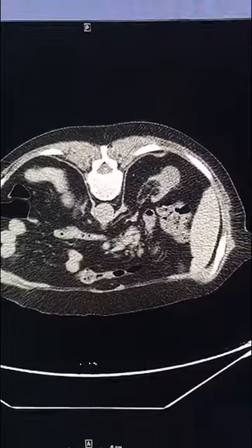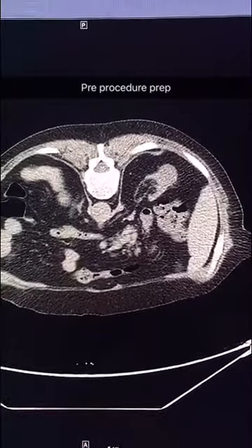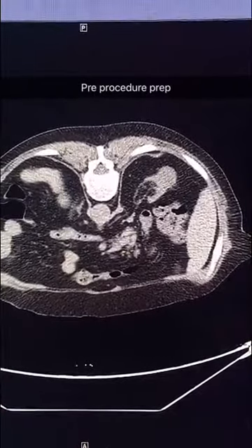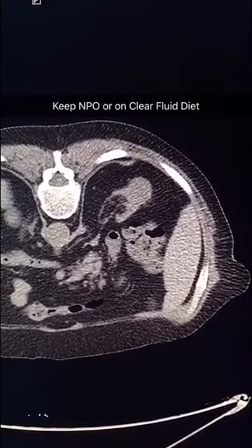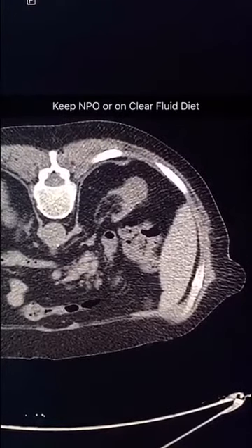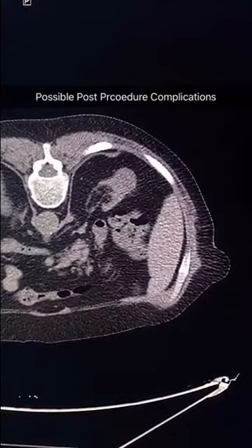The patient was admitted the day before. We reviewed her lab work, including PT, INR, and platelet. She was kept fasting for at least 4 hours. You can also keep her on a clear fluid diet for 6 hours. The reason for admission is to manage possible post-procedure complications, including bleeding, injuring other structures like the bowel, vomiting, and pain.